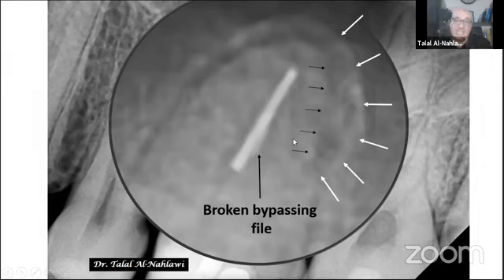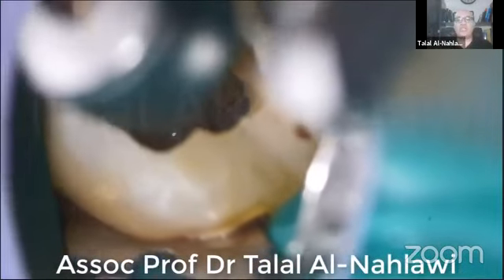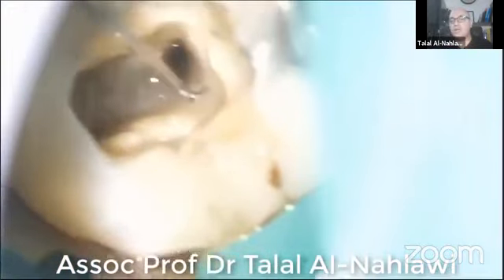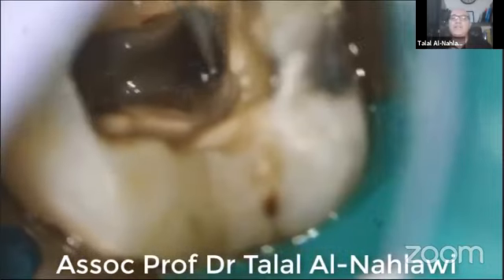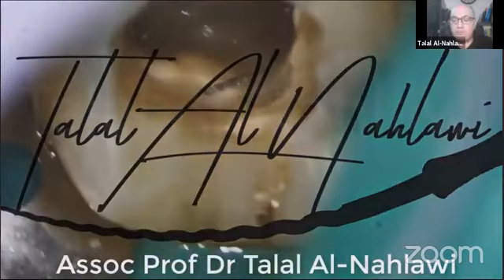Although this case is indicated for bypass, here I have to shift to another treatment modality, which is removal, especially since I'm dealing now with a palatal canal. And you all know that the palatal canal has a good mass of tooth structure, and I was removing just a little bit palatally, and it was already enlarged because the dentist had put a screw previously. So I removed the first one. I started to remove the bypassing one, and then I used the U file because the U file is very thin and will give you a very nice result. Although this was a palatal canal of 24 millimeters, I had to remove it.